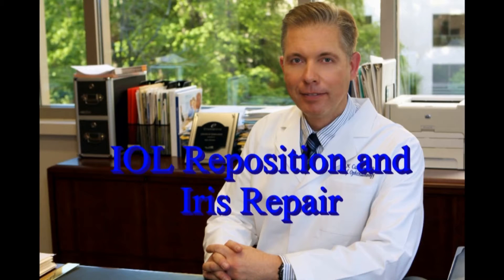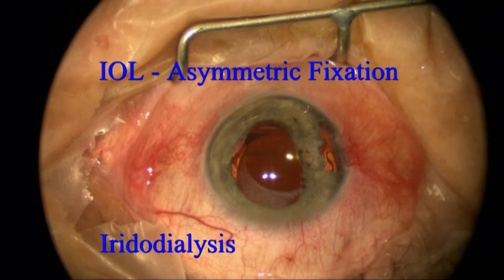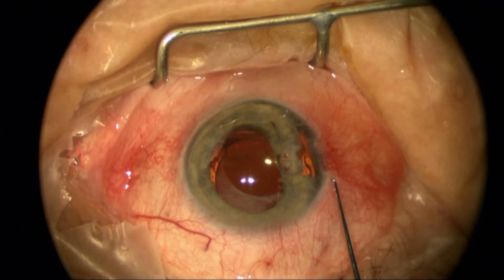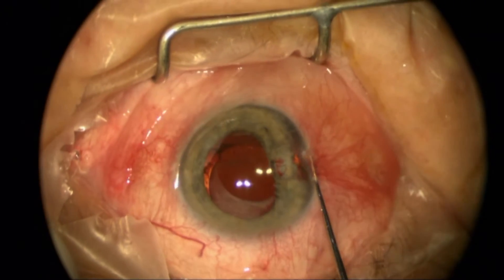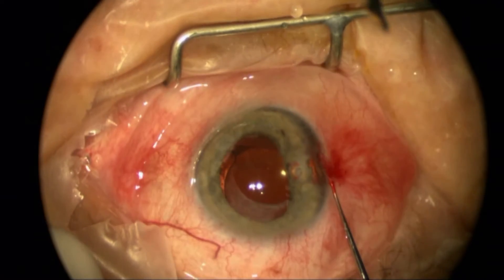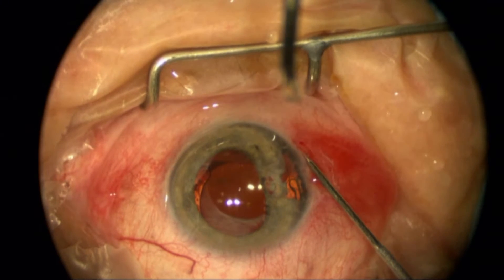This next patient is a complex patient sent after a previous cataract surgery. You can see here an intraocular lens that is asymmetrically fixated, and also quite a bit of iris injury with even conjunctiva scarring up to the wound in a pterygium-like process that I'm removing and doing very light cauteries.